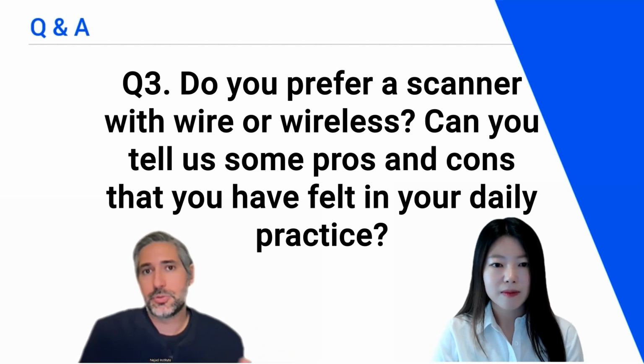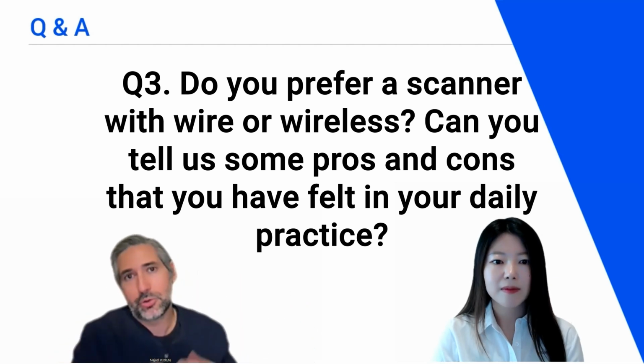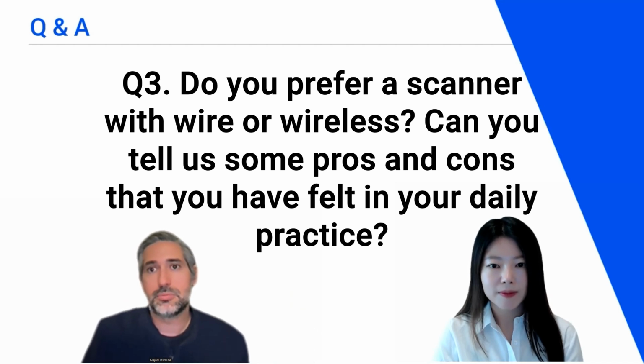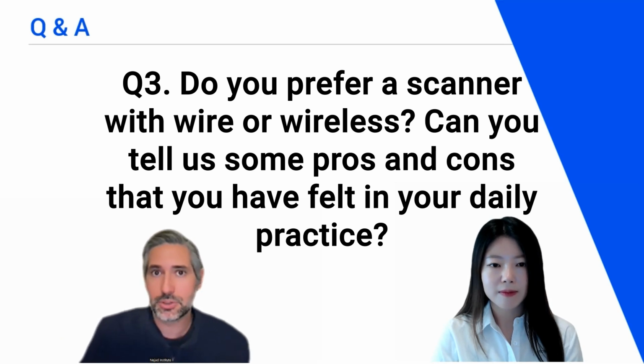I think there are some huge benefits to that for me because I have my computer at 12 o'clock. The wire has to come over my shoulder or the patient. So it's just ergonomically better and more comfortable for me. I never have to fight the cord. The only thing you need to balance between wireless and wired is battery life, but we have 3 batteries, so I don't need to worry about that. We have the backup connection where you can make it into wired if you want to. So if it were me, I would get a wireless as my only scanner. And if I needed to use it in a wired way, you always could do that.